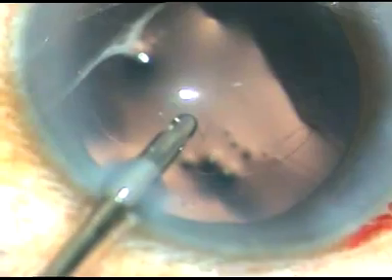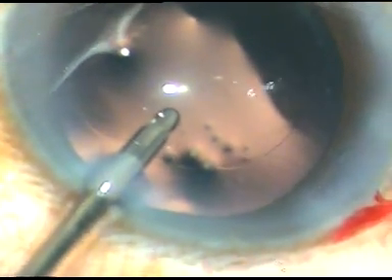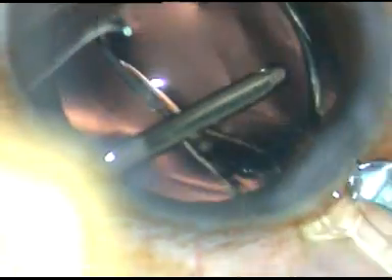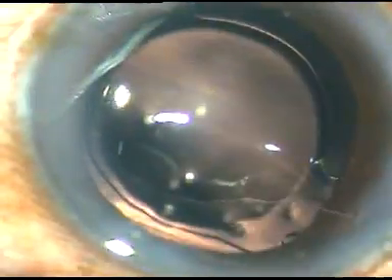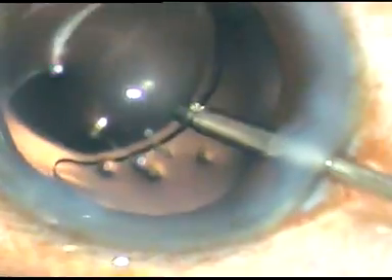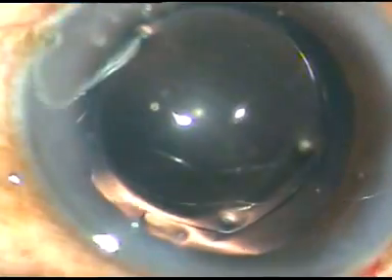Now a hydrophilic acrylic intraocular lens is being implanted, keeping the anterior chamber formed by continuous irrigation. The lens is placed inside the capsular bag by the irrigating probe, which is then used to flush out any remaining viscoelastic substance from inside the lumen of the cartridge.